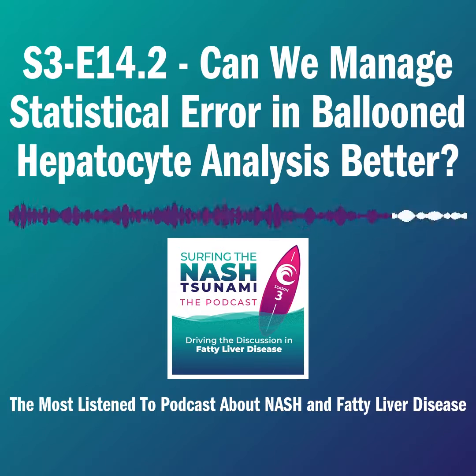But we now have the Davison paper and this work to tell us that the semi part of semi-quantitative, and the error associated with semi, dwarfs the error associated with quantitative per se. So we're powering studies based on the assumption that error is all statistical. And in fact, error is far more observational than it is statistical, and you can't put error margins around that stuff. You simply have to improve it. And the way to improve it is either forget about it or quantitate it. So when I listen to you, and I listen to Mazen asking, well, are there situations where we should forget about it, and you saying, really, what we need to do first is figure out if we can better quantitate it. Does that make sense?